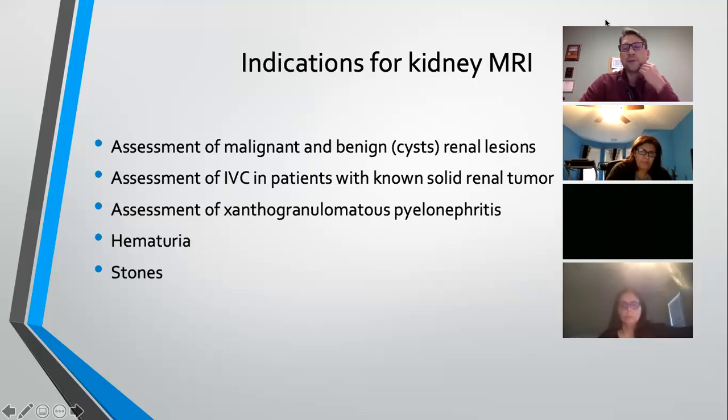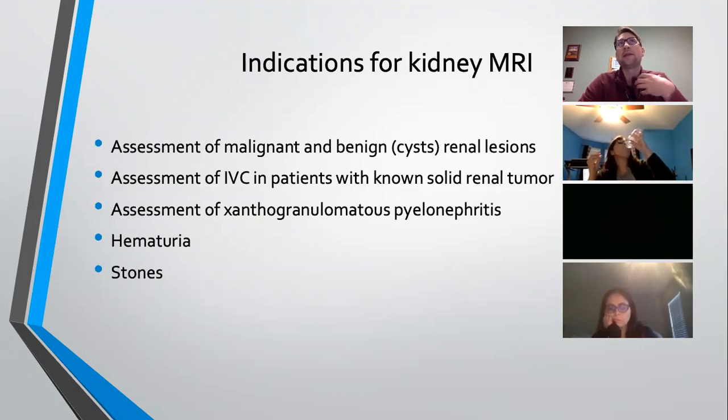But who was I with the other day? Tisha, I think it was, and they were scanning somebody who had polycystic disease, and they were assessing for a kidney replacement, a renal transplant patient. Yeah, a transplant patient. Thank you. That's what they're doing, a transplant patient with polycystic kidney disease. So that's a very common reason you scan the kidneys specifically.